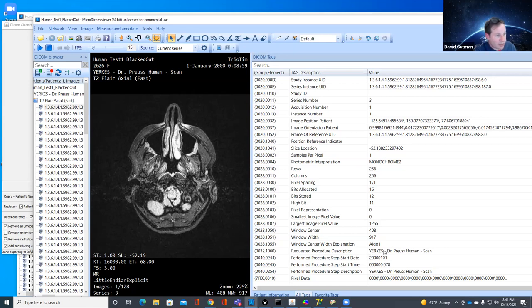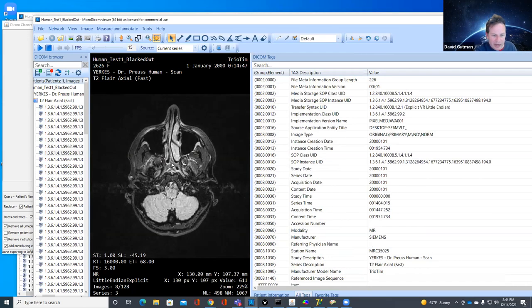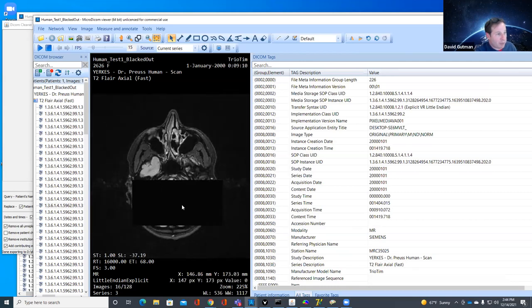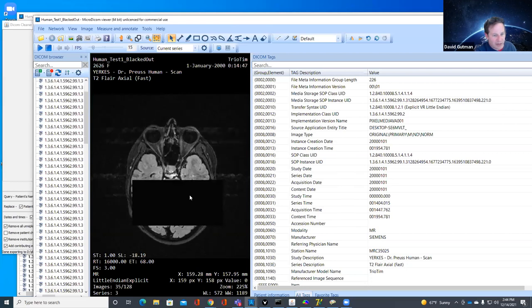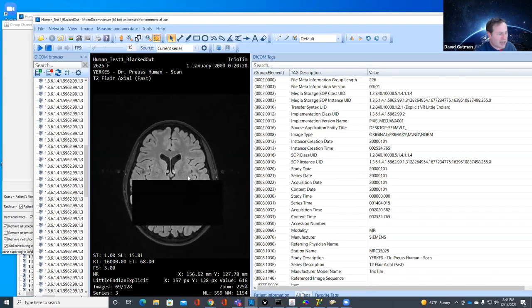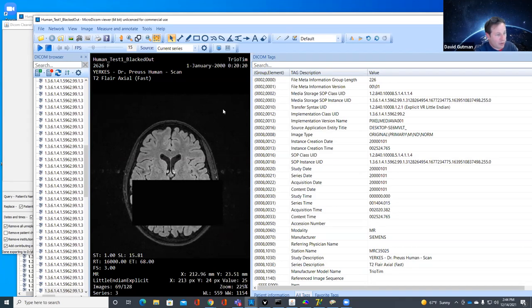The only thing arguably still problematic is the series description, which I'd just have to run the tool again to fix. What I wanted to show you though is that it did black out the box where I said there's probably something I need to get rid of. In most MRI images it seems relatively uncommon to have text burnt in for a T1, but it usually appears in the upper left or upper right-hand corner.